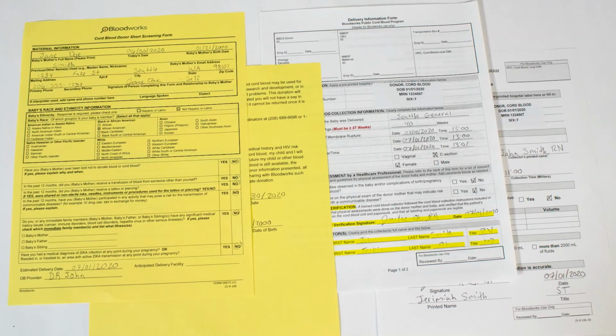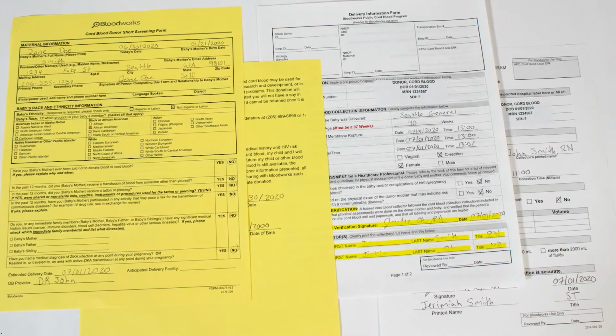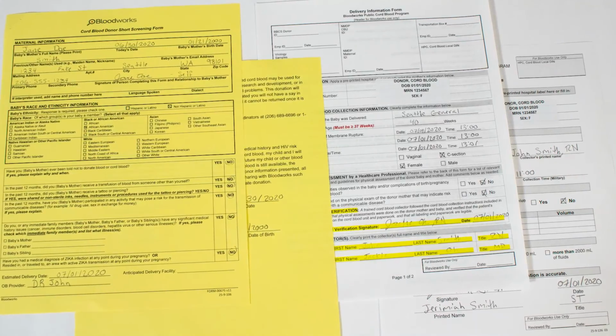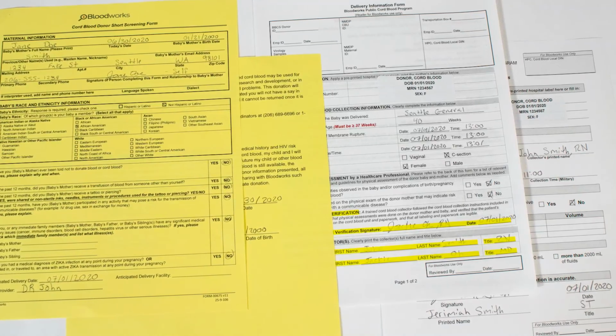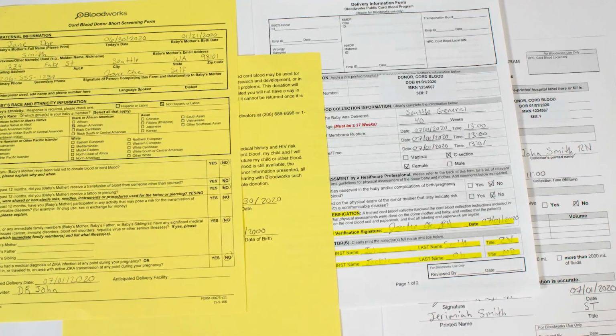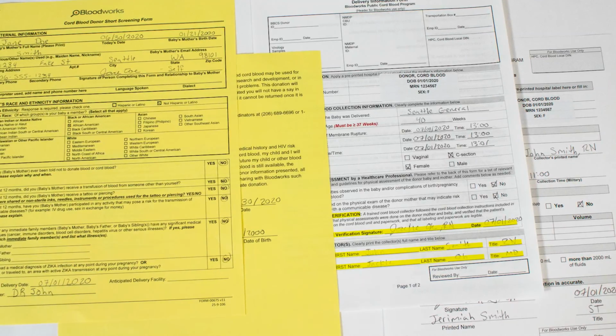To return the cord blood unit, you'll want to ensure that the 4 vital pieces of paperwork are returned. This includes the cord blood short screening form completed by the patient, a consent form from the patient signed prior to the collection of the cord blood, a filled out delivery information form with signed cord blood collector at the bottom, and then maternal sample form that's been completed by a medical professional.